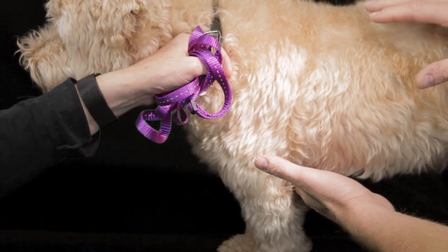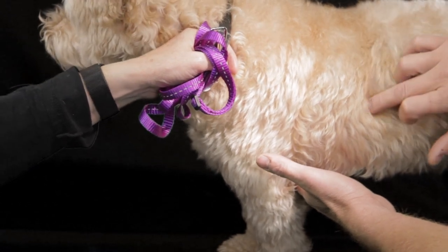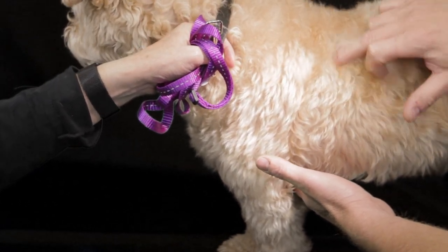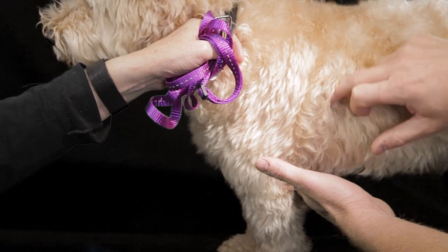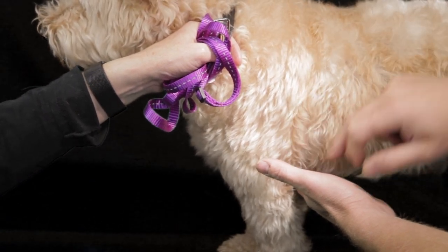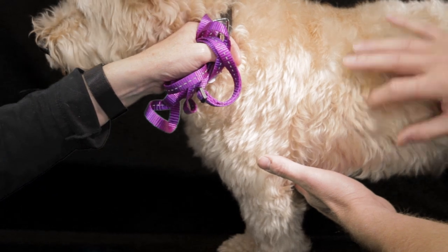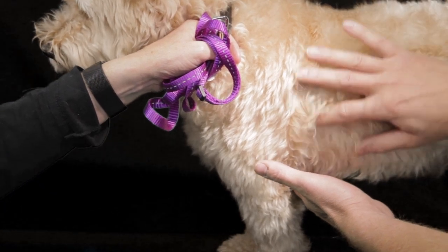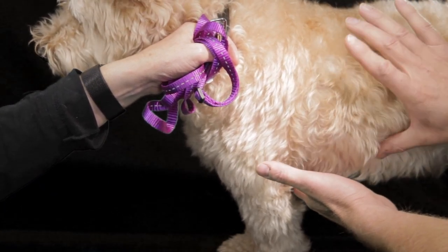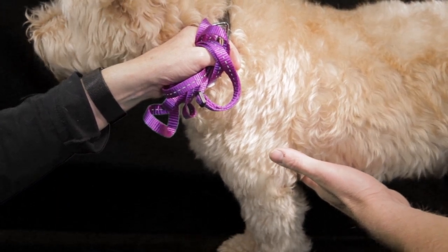The other approach is to place the probe between the ribs and do a sliding lung ultrasound. We'll move the probe ventrally and dorsally between the ribs, checking first for a glide sign and then looking for interstitial alveolar pathology as we move up and down the ribs. Whatever we do on one side of the chest, we're going to repeat on the other side.